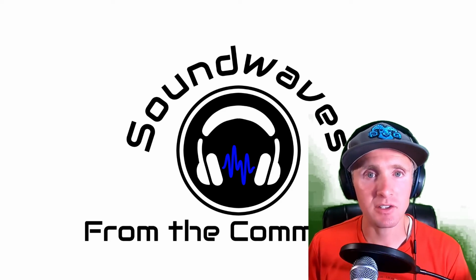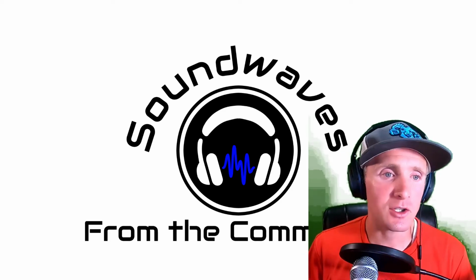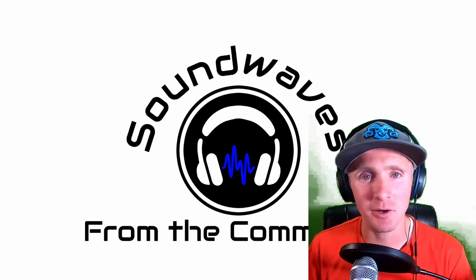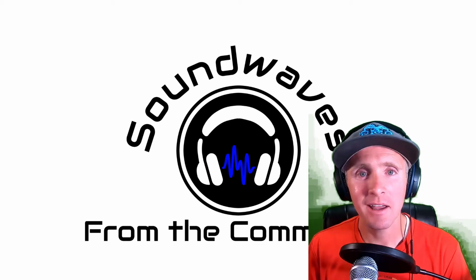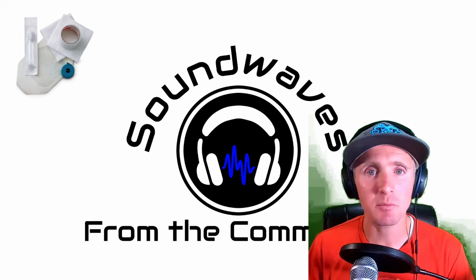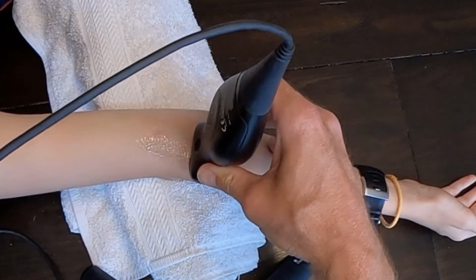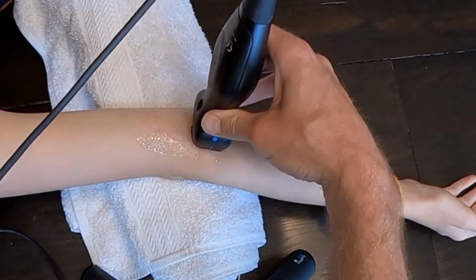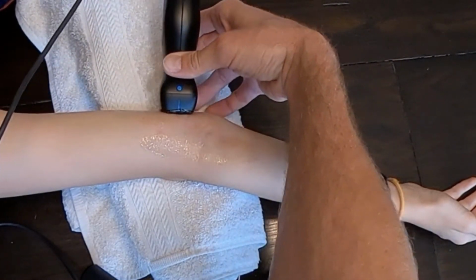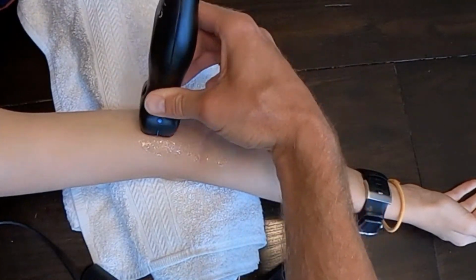I guess the other part of this is just the procedure itself. Obviously you're going to want a tourniquet, unless you're doing ultrasound-guided IJs, where obviously you don't want a tourniquet around the patient's neck. But anywhere else you're going to want a tourniquet to try and get those veins as big as possible. What I like to do, especially on the arms, is get a towel, roll it up, and put it underneath the arm. So instead of having their elbow crooked down and bent, you can get it nice and straight, so that you've got a nice straight trajectory.